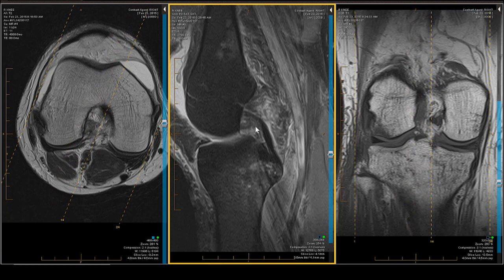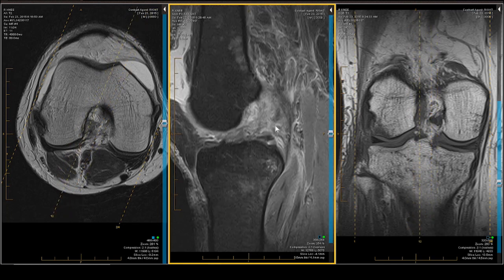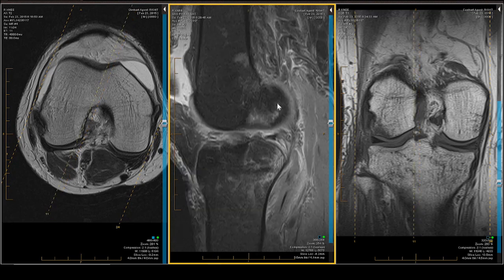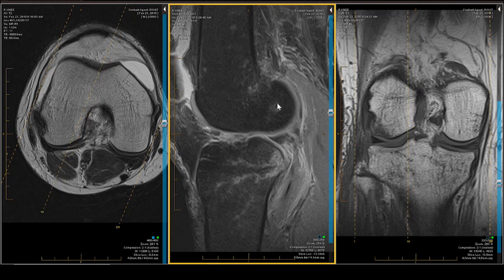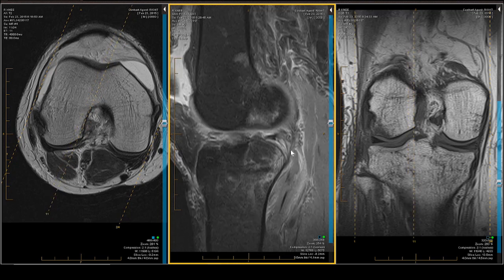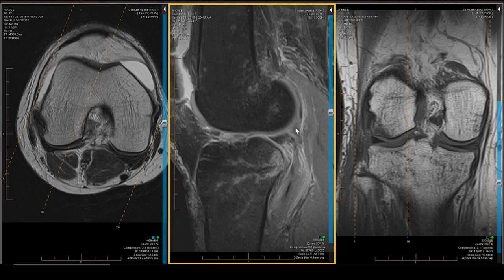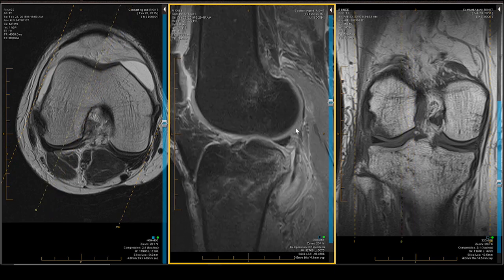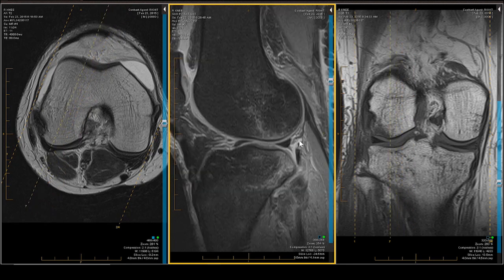The PCL is intact. The posterior capsule — which also has the OPL fused to it — is torn superiorly, right there. It should attach there but all you see is an area of fuzzy gray signal intensity. There is a little more capsule that is certainly swollen as we get into the posterolateral meniscus.